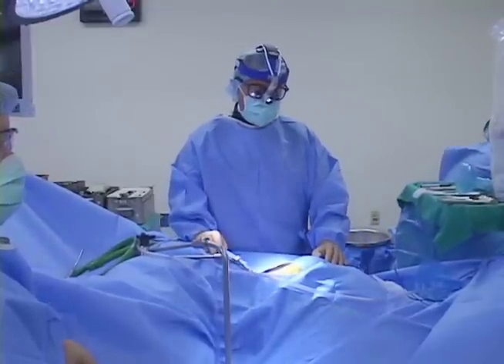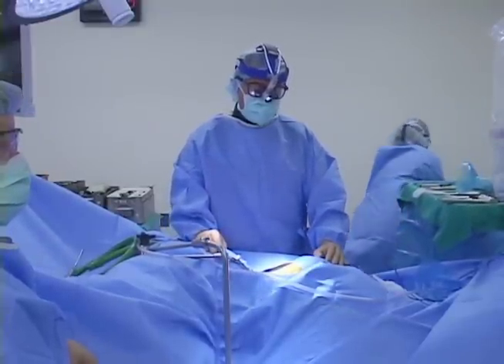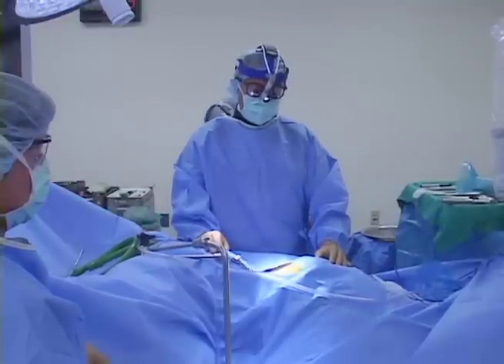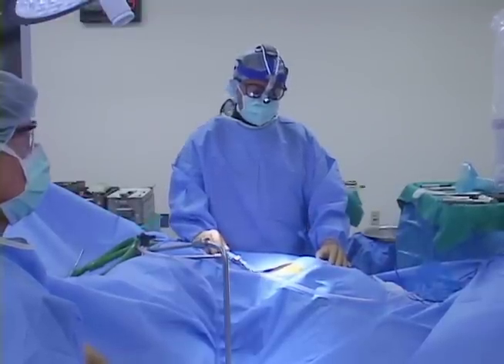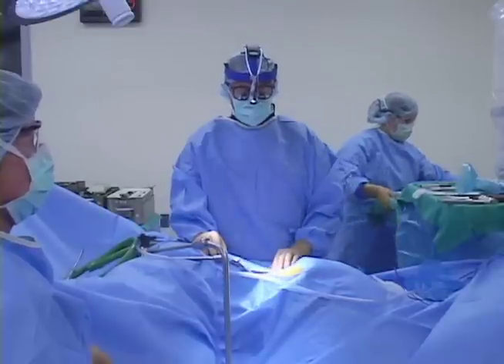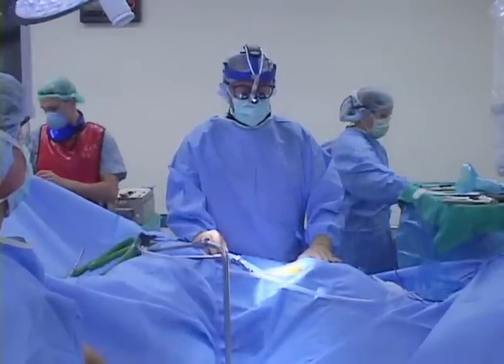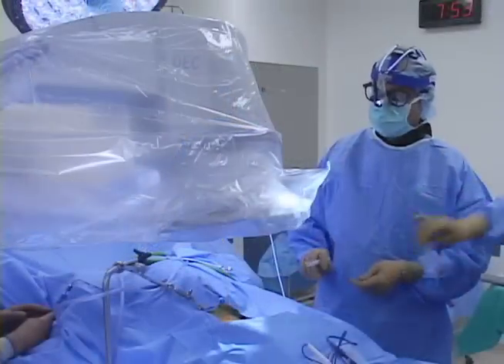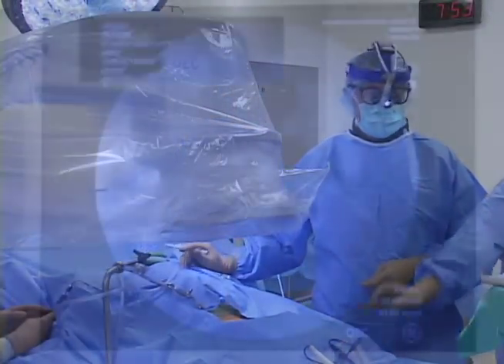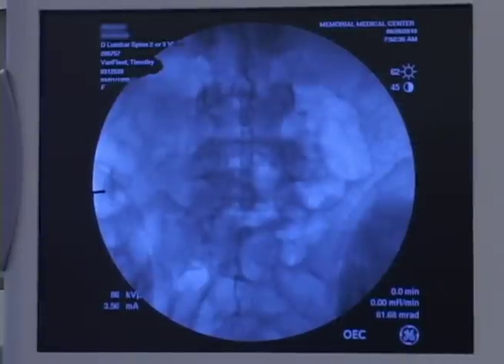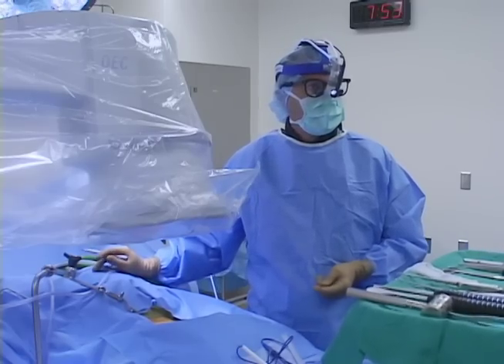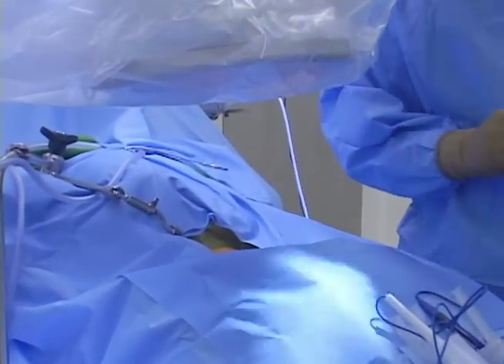I'm going to make an incision on the right side of her back, which is about an inch in length, perhaps about four centimeters off the midline, which is over the paraspinal muscles. We'll take this approach down to her facet joint at the L5-S1 level with a series of dilators. We'll obtain an AP image and get a parallel view of the L5 disc space, which is the disc we're addressing, and then make the incision.